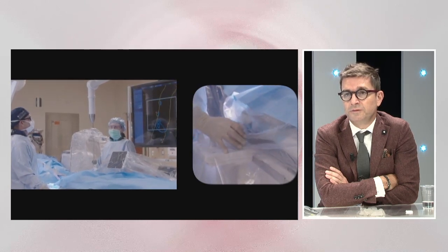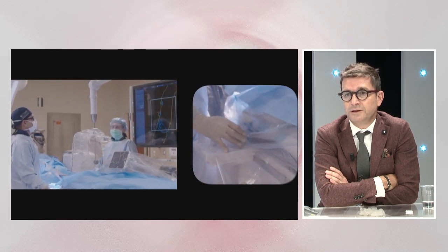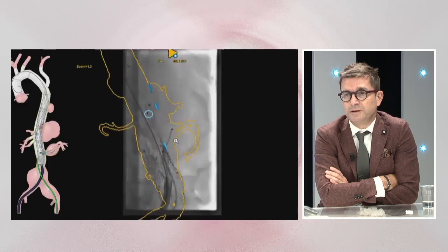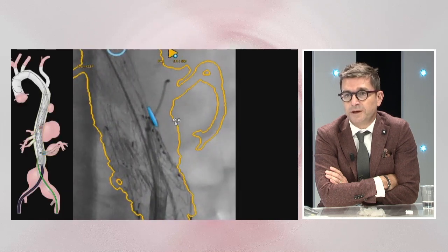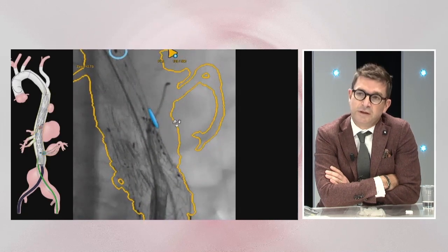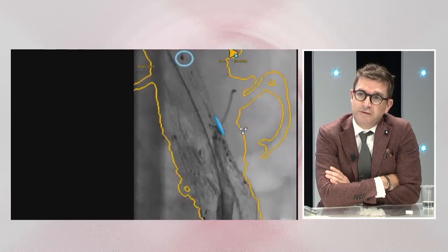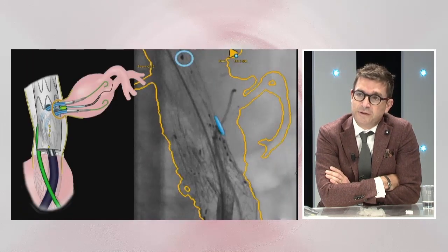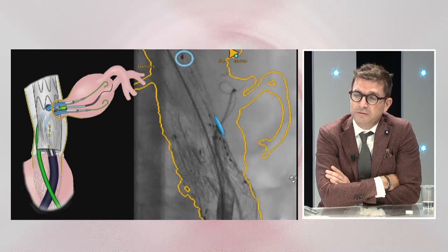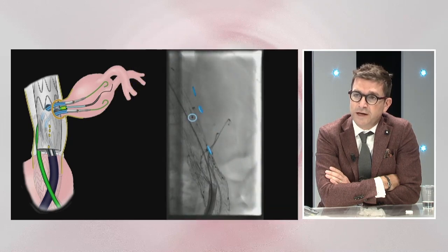A lot of this case was done in lateral view. What you're seeing is not magnification but digital zoom — I'm setting up the digital zoom here on a 50×50 field of view, collimating on the digital zoom before stepping on the pedal. You can see how nice the lateral view is without the arms, really optimizing visualization.